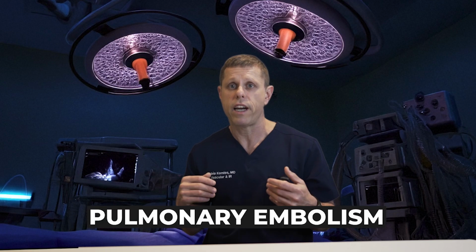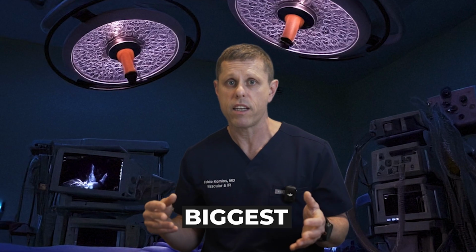In those cases, you may consider putting a filter to prevent pulmonary emboli during this period, since pulmonary emboli is one of the biggest causes of death in those patients. And we do so knowing that we can remove these filters once the patient is back to normal and walking around.